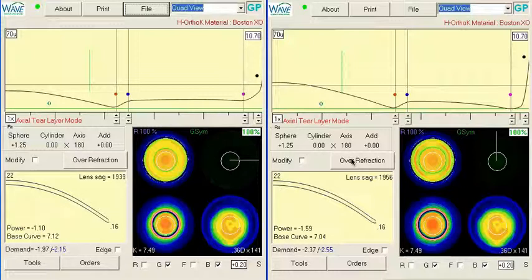The topographies show there's pretty good change to the cornea, but refractively, the full manifest refraction is still coming through. I don't know if maybe the patient was just having a bad day, or maybe the hyperopia has progressed. In either case, the second lens isn't working.